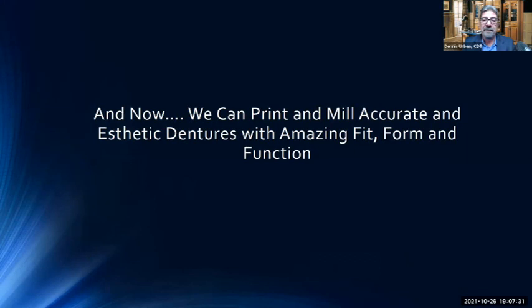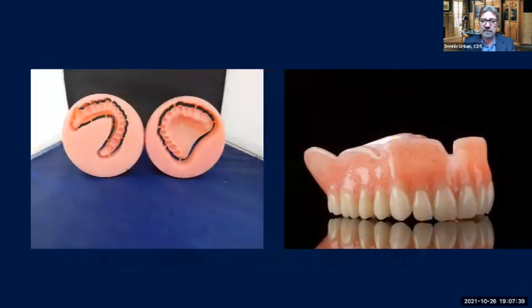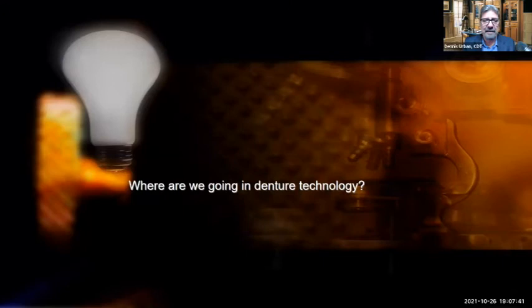So now we can print and mill accurate aesthetic dentures with amazing fit, form, and function. And we're going to talk about printed technology in a little while. This is mill technology here. We'll talk about that. But where are we going with denture technology?